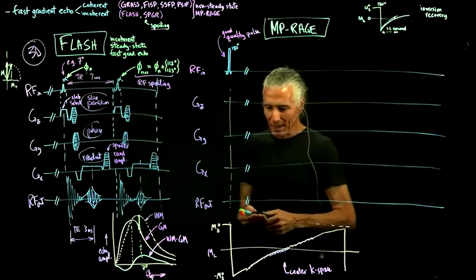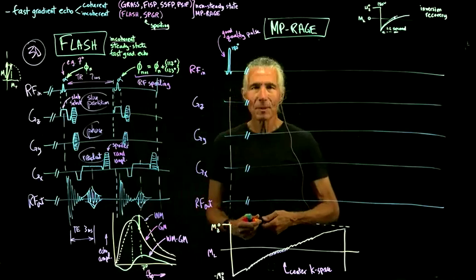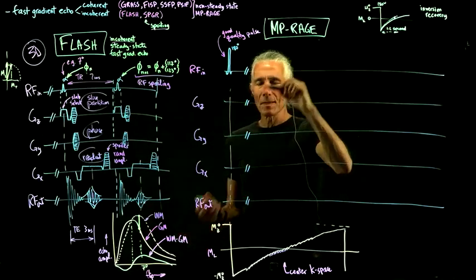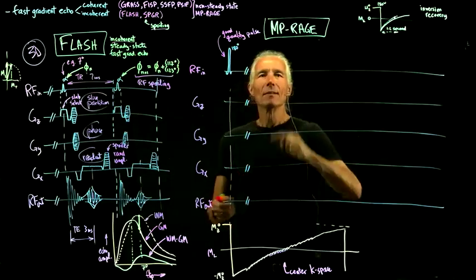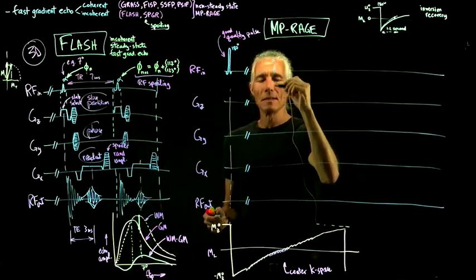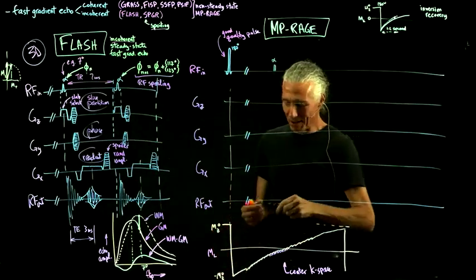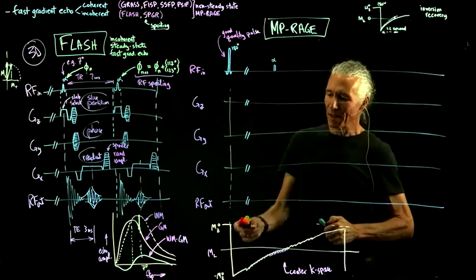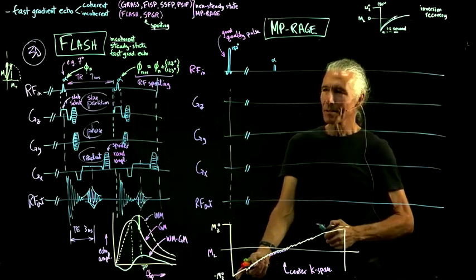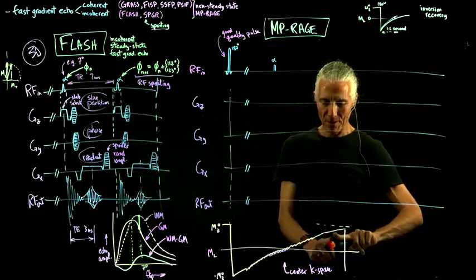And so what does the pulse sequence look like? Not too much to it. We just have a bunch of alpha pulses, and these could be relatively sloppy pulses, even just hard pulses. So here's an alpha. And so what does this sequence sound like? If you're in the scanner, I've sat in the scanner, you hear a little gap in time here, and there's some gap here too.